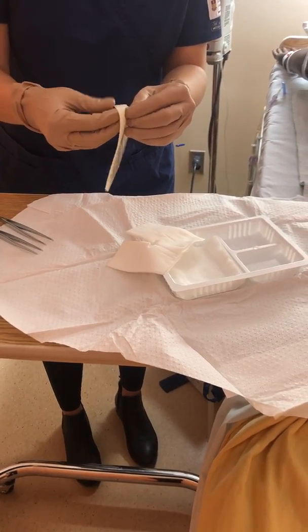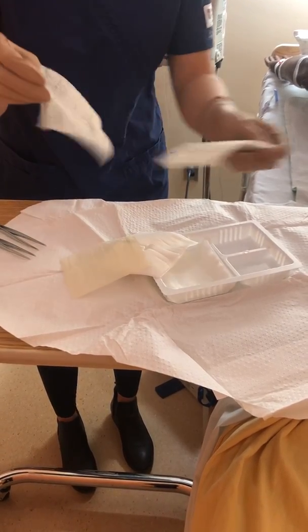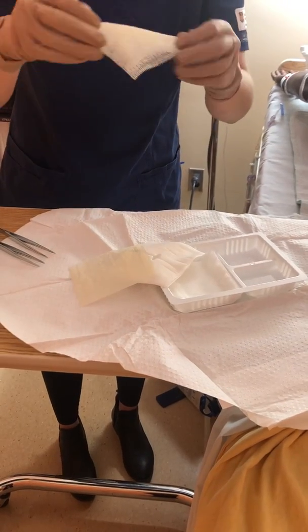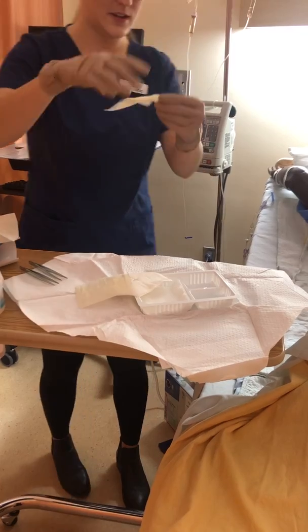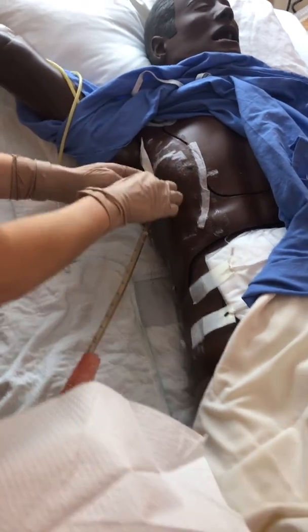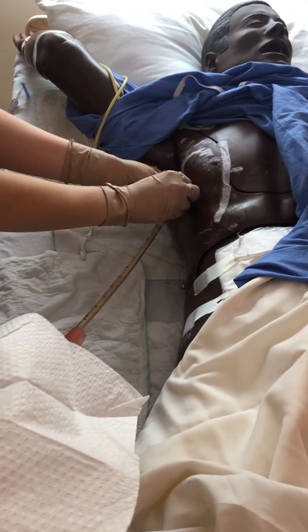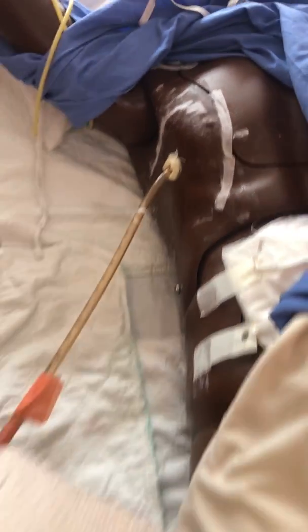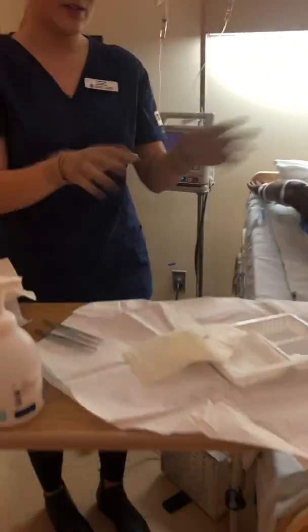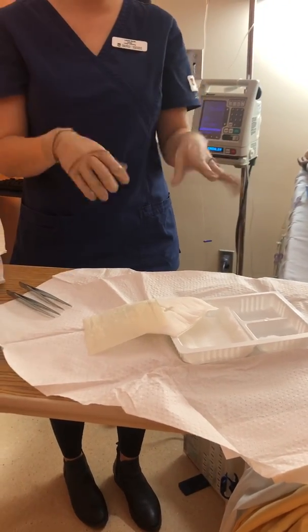So I'm going to take off that. So I'm going to make sort of a little twist here with this. I'm going to start, make sure not to touch anything unsterile here. So I cleaned around everything. So wrap that around. Make sure it's occlusive. So that looks good. So now my hands are no longer sterile.